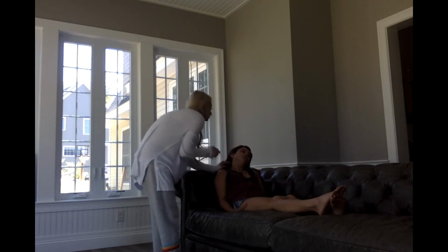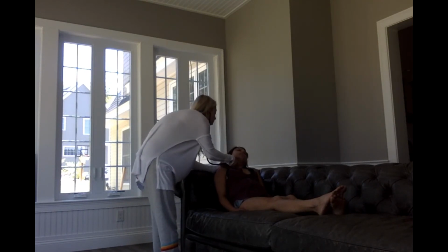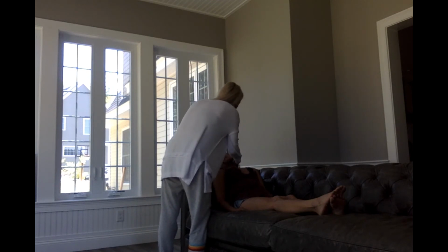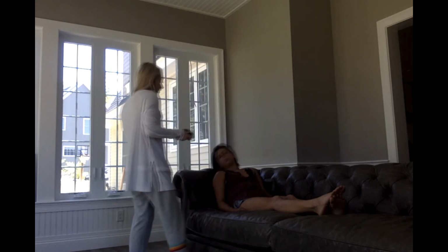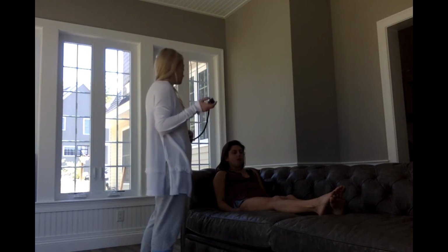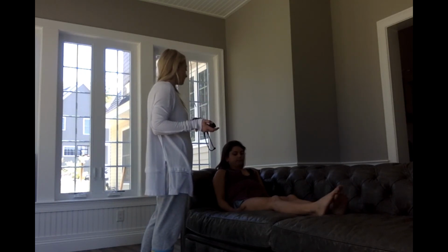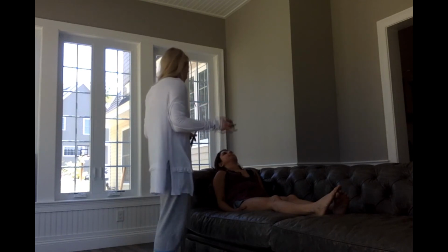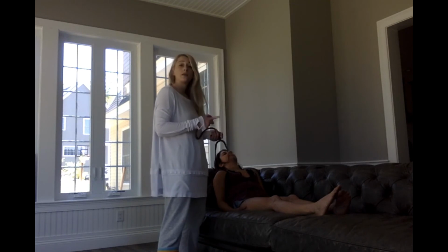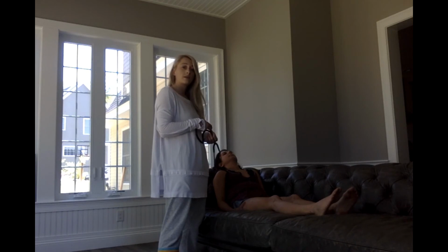Alright, so if you can just breathe in and then hold. Okay, good. Let it out. Breathe in. Okay, let it out. Okay, good. So that sounded good. A nice, steady, even, regular rate. Now we're going to auscultate and listen for heart sounds. Okay, so we're going to do this by listening to the aortic, the pulmonic, Erb's point, tricuspid, and mitral.